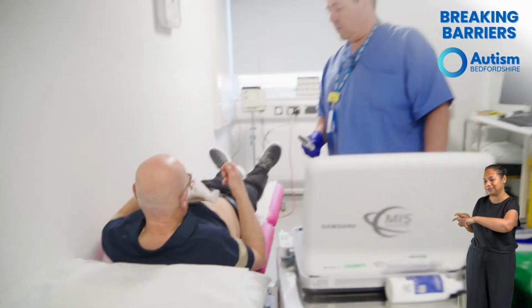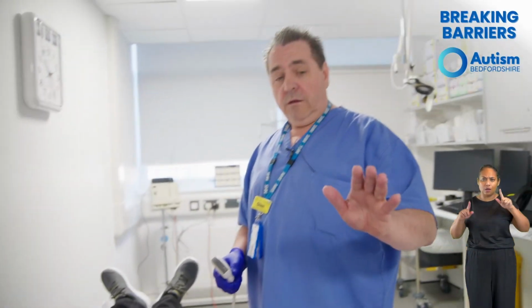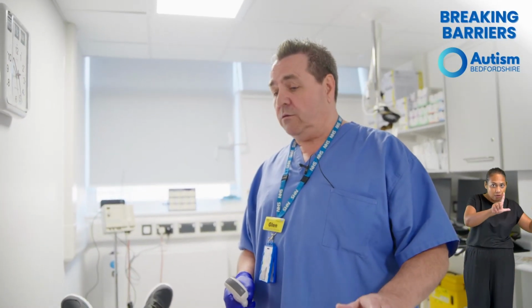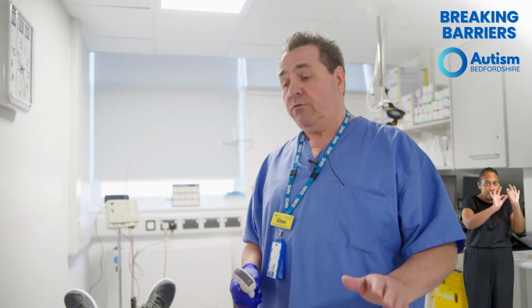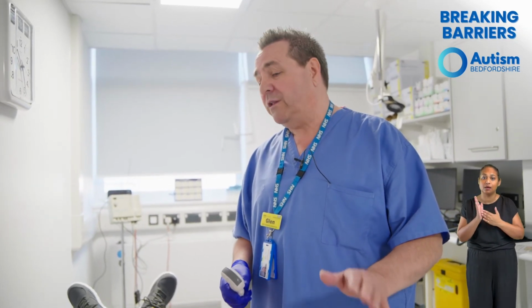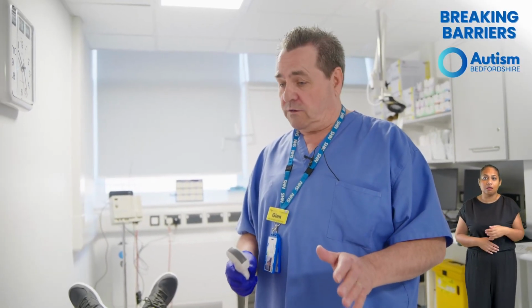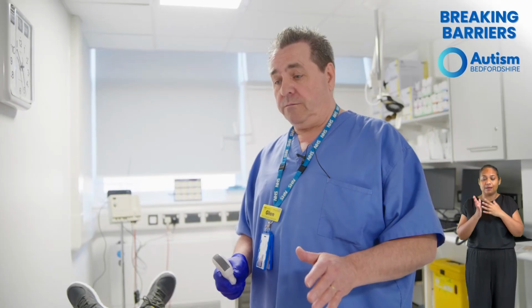So, when we do a scan for you, what we do is we take images and we measure those images to check they're below 3 centimetres. Okay. Yours is measuring around about 1.7 centimetres. So you're well below the 3 centimetre threshold for an aneurysm.